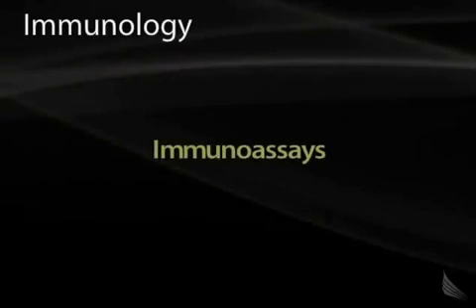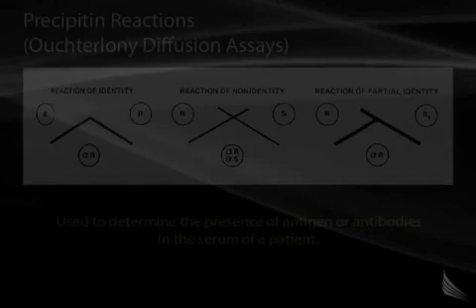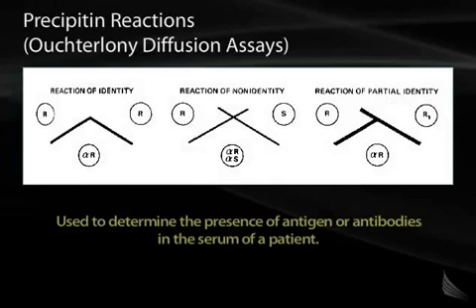In this section, we will cover immunoassays. In this section of the lecture, we'll discuss a few of the immunoassays that might pop up on the boards. The first one that we'll talk about is the precipitin reaction, or the Ochterlony diffusion assay.